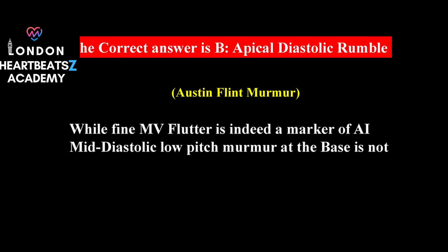That makes sense. It's a reminder that M-mode, while powerful, is just one piece of the puzzle. Right. It's about combining its insights with other clinical findings to get a complete understanding of what's going on.